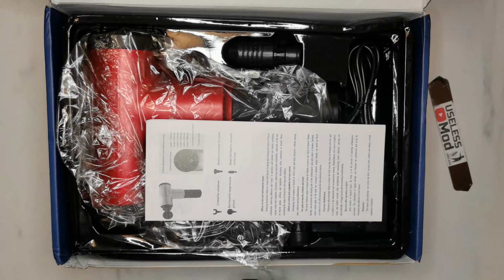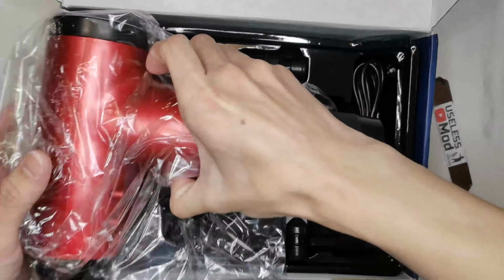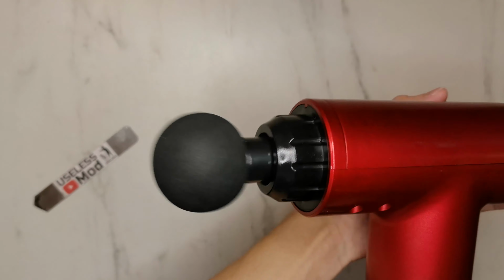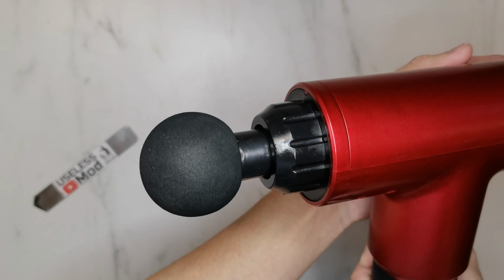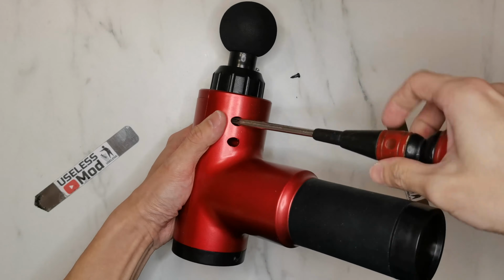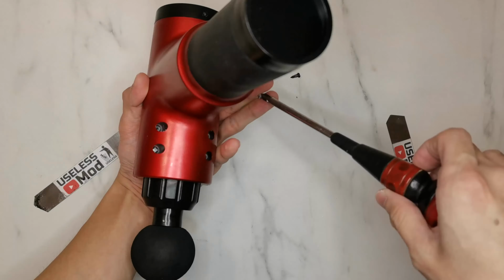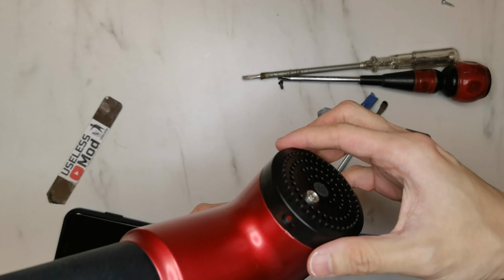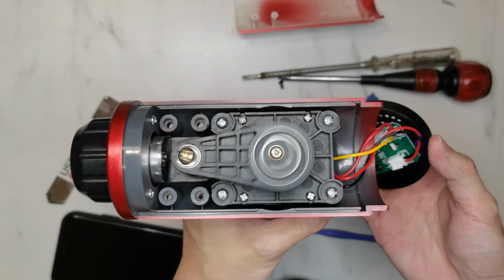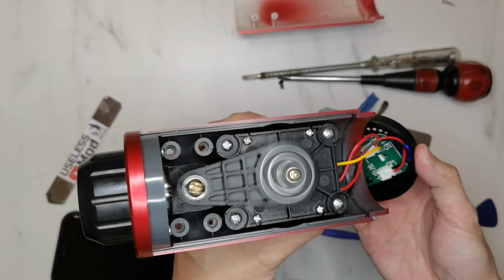I bought a brand new, very cheap China massage gun for this project. After I check everything's working, I start to disassemble it. First, remove all the visible screws from the outside. Twist to open the rear cap. Now we can see it's actually a very simple mechanism.